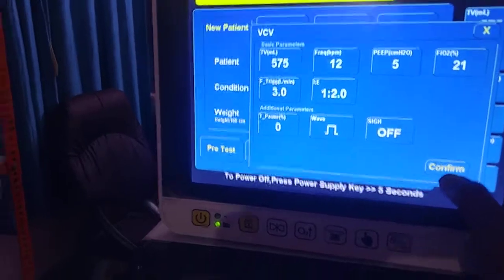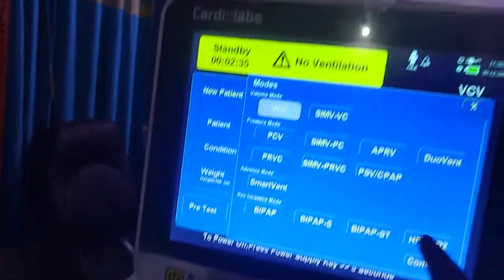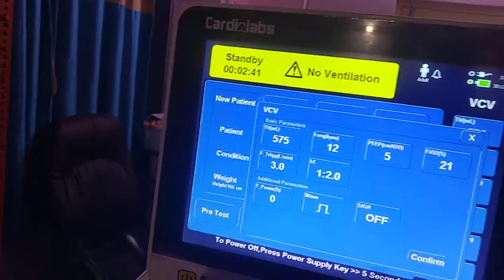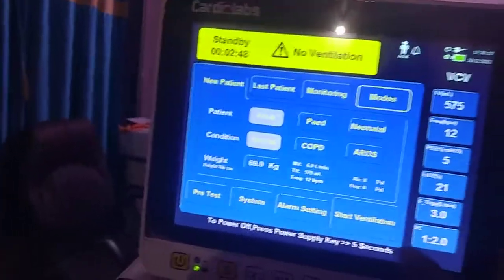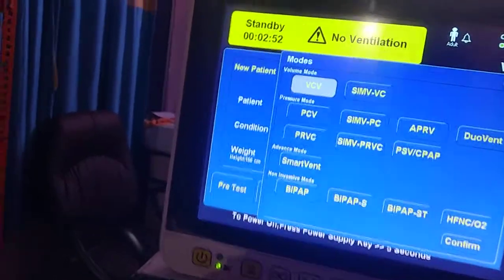After confirming, it will allow you to adjust parameters. For example, if you want to start with VCV, confirm it and it will let you set the parameters, change whatever you need, and then start ventilation directly. Before going to start the ventilator, I would like to show you the available modes.